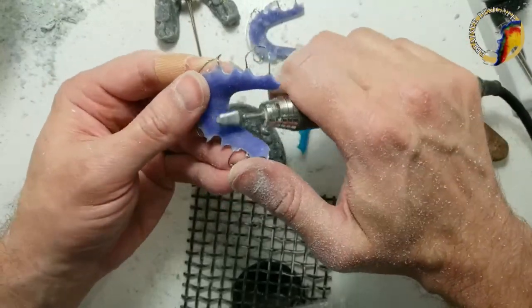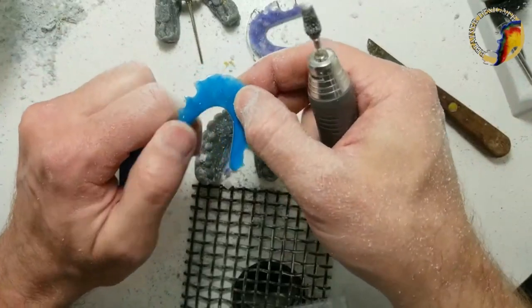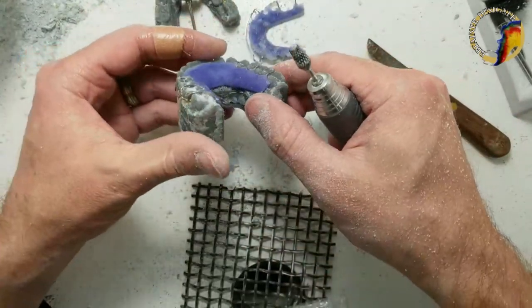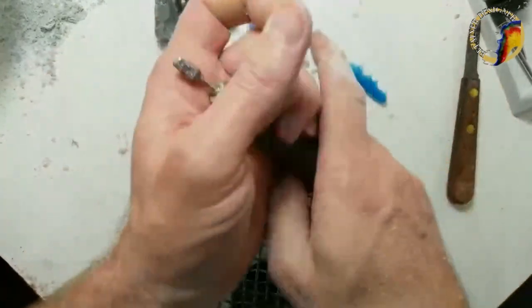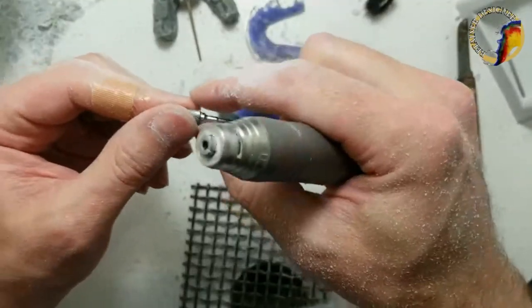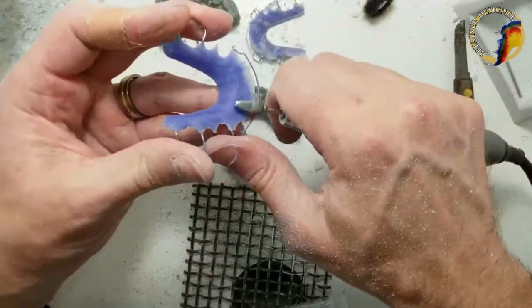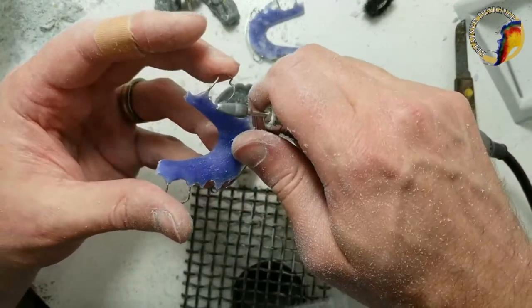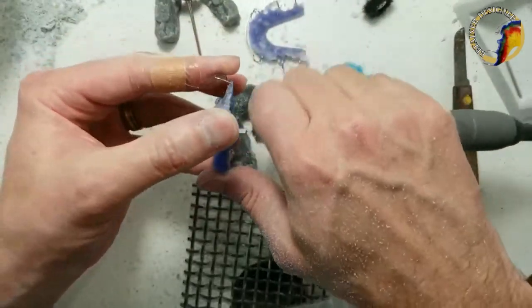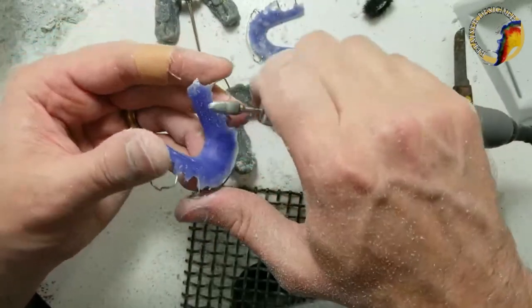It's good to have the old acrylic handy — the patient is used to the feel of that acrylic in their mouth. If you go and change it a lot, it'll take them a while to get used to it. You can go to a finer-tooth burr for any final finishing. Those little metal hairs from the bristle brush — you don't want them in your handpiece. I actually use this burr for trimming solder joints too. You can skip this step and go straight to sandpaper.